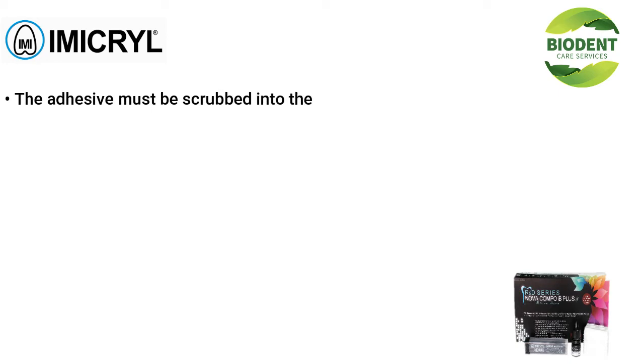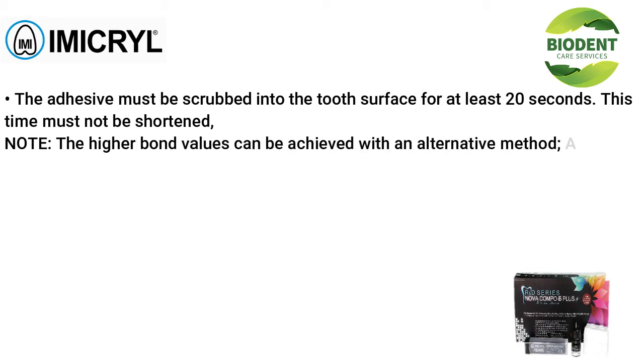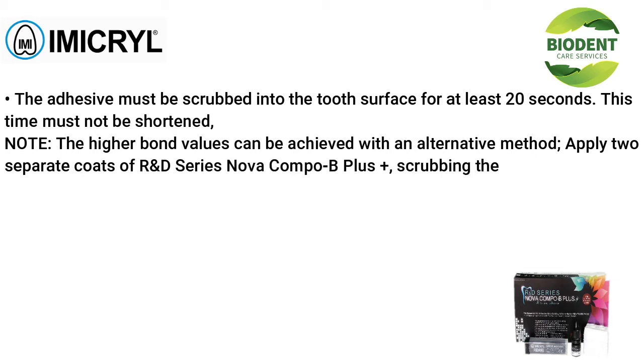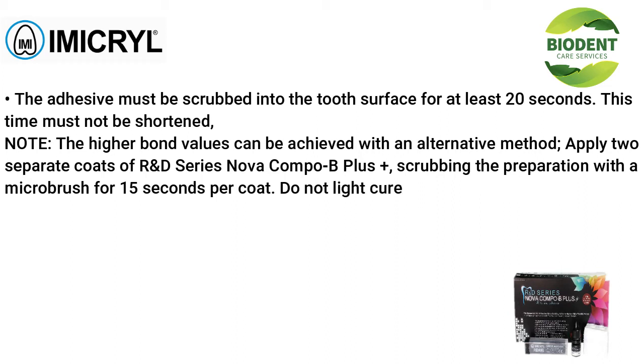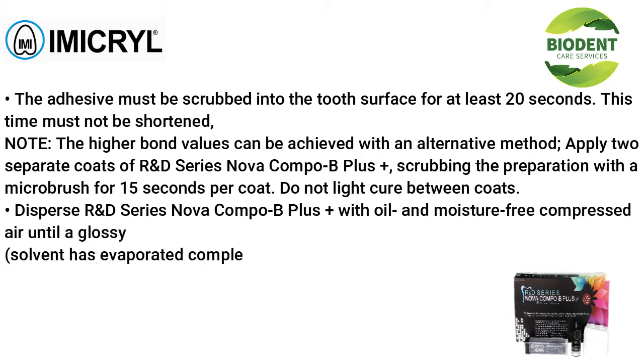The adhesive must be scrubbed into the tooth surface for at least 20 seconds. This time must not be shortened. Note, higher bond values can be achieved with an alternative method: apply 2 separate coats of R&D Series Nova Compo B+, scrubbing the preparation with a microbrush for 15 seconds per coat. Do not light cure between coats.